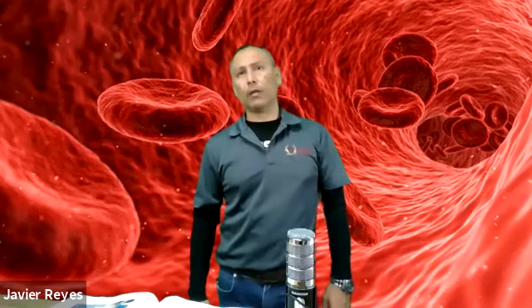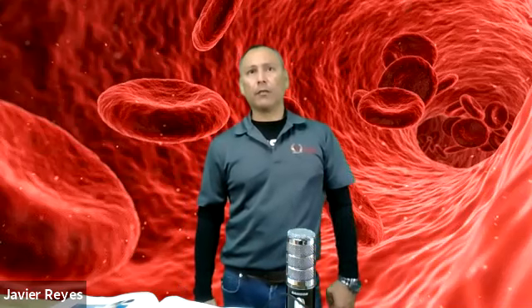Again, we have to keep in mind the type of test that needs to be performed and processed so that we can collect enough blood for the test. Risk of injury due to restraints needed for venipuncture. Many times, kids will not cooperate, and holding kids in place can become very challenging. They can get a little strong, and if we're not careful enough, we can actually injure them. So, in that case, we would just perform a capillary puncture. Capillary blood is the preferred specimen for some tests. Some physicians will specifically ask for a capillary blood sample versus a venous blood sample.